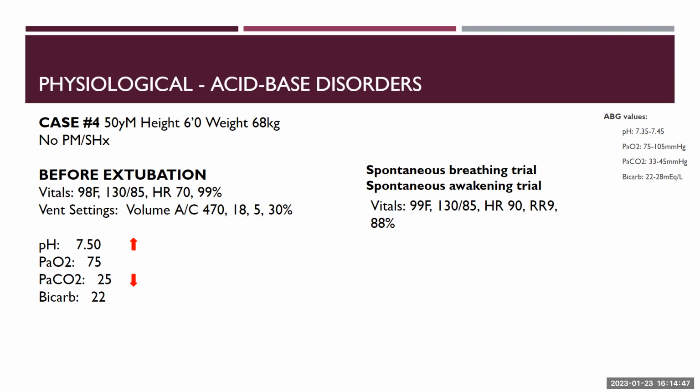How about Jessica? Do you want to add anything else? I mean, I had a question just about this patient having such a low CO2 before doing a spontaneous trial, but I don't know if that's part of the question you were asking in terms of what the trials are. Yeah, that's a good point to ask, because that's part of the trial.